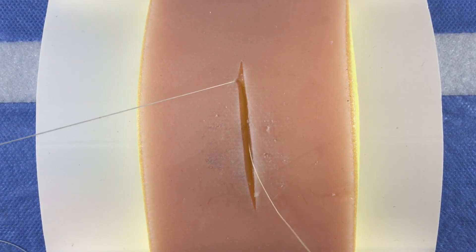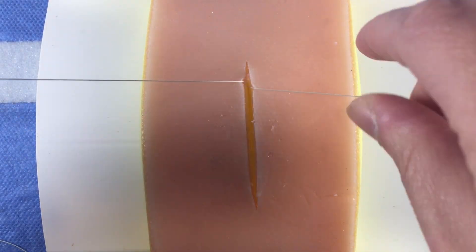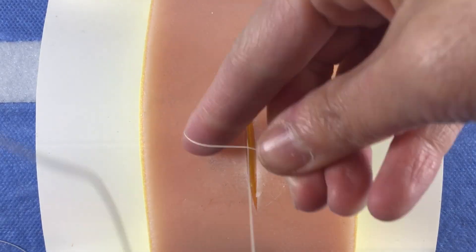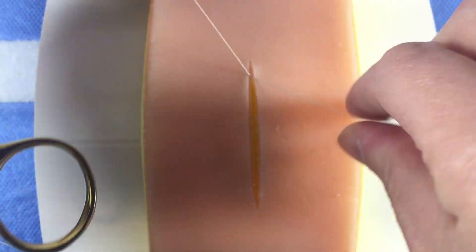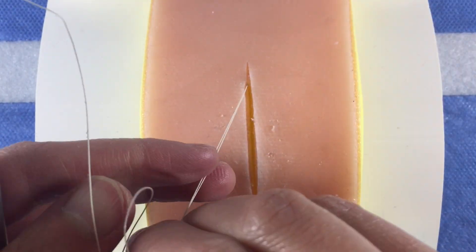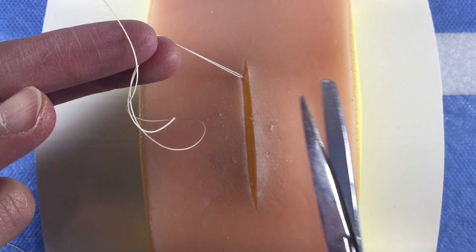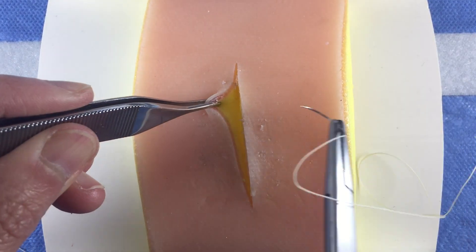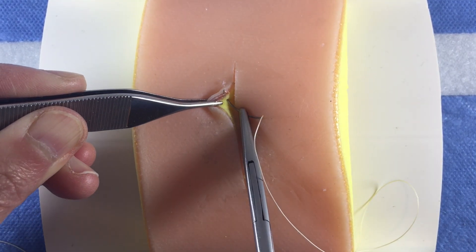Note that both suture strands are deep. Tie the strands together and cut the sutures short so they are buried under the surface. Continue to place these sutures about 7-10mm apart along the entire length of the incision.